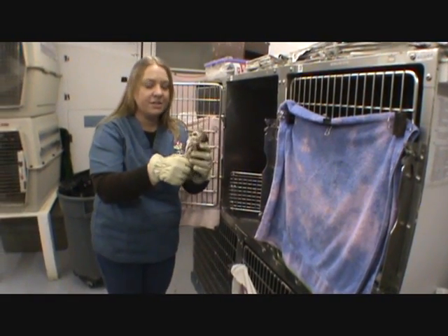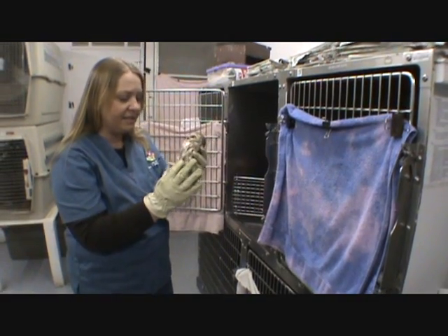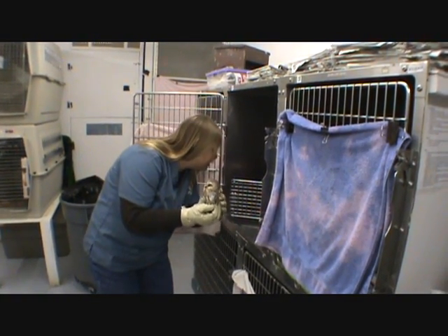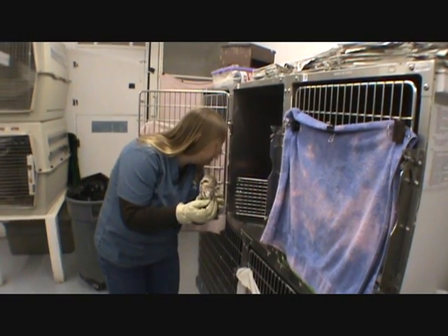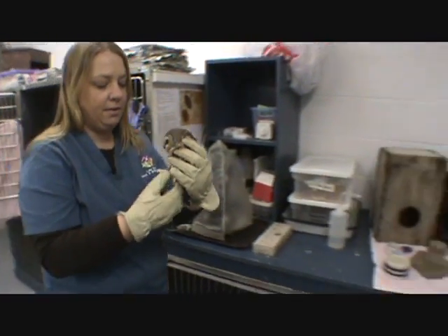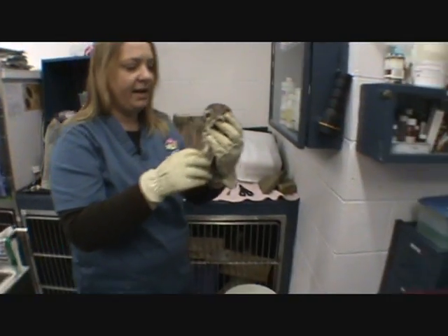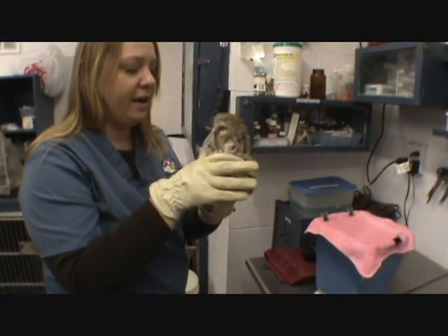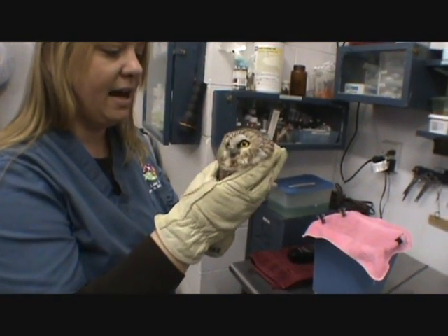This is a northern saw-whet owl that we received in the rehab program yesterday. It looks like he tried to eat a little bit of his chick last night. We're going to get a weight on him today and we're going to try and wrap up his wing — he has fractured metacarpals on the right side.